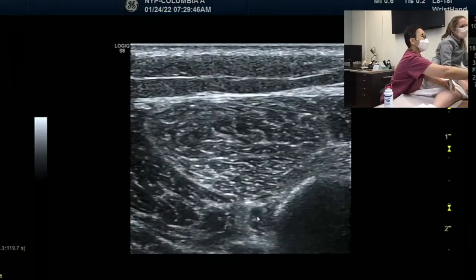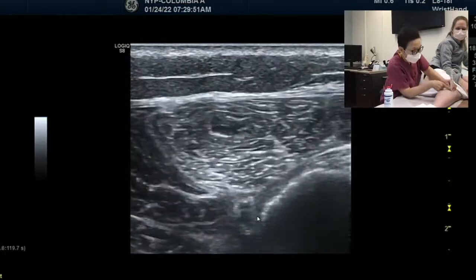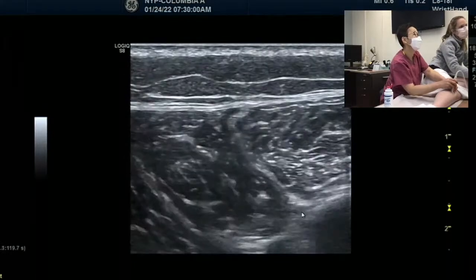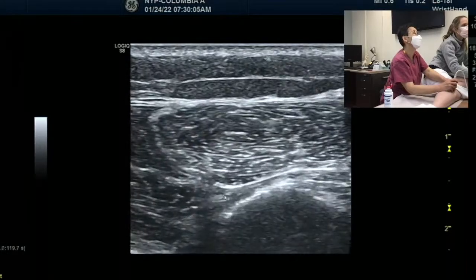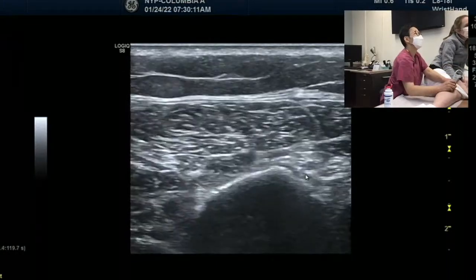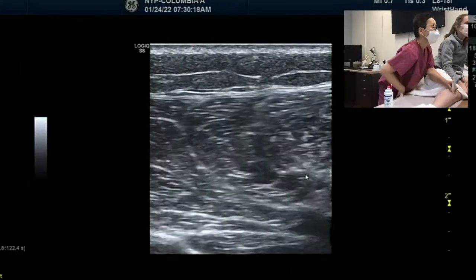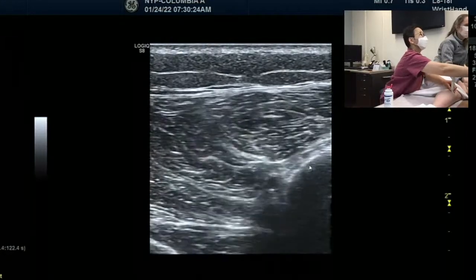Look at the anterior tibial artery coming here. The nerve always moves with the artery, right? Look at my probe, it's moving into the front part of the leg. Do you see it? The nerve is moving to the front. Pay attention, see it coming down? Yes. We have to make it a little deeper. It's going toward the interosseous membrane, which we expect.